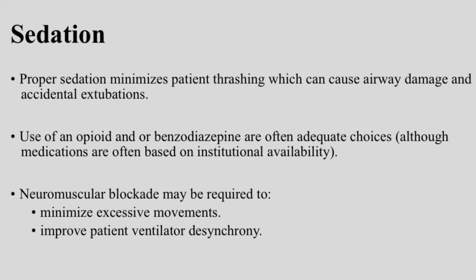Sedation. Proper sedation minimizes patient thrashing, which can cause airway damage and accidental extubations. Use of an opioid or benzodiazepine are often adequate choices, although medications are often based on institutional availability. Neuromuscular blockade may be required to minimize excessive movements and improve patient ventilator desynchrony.